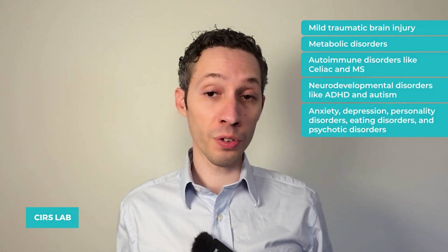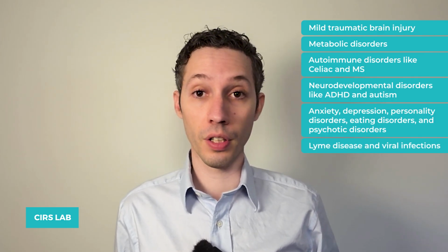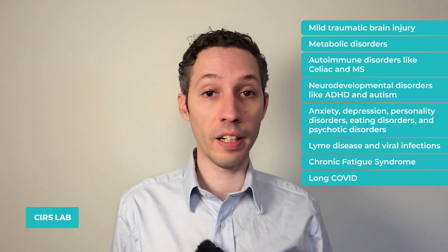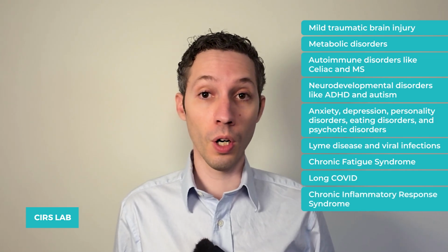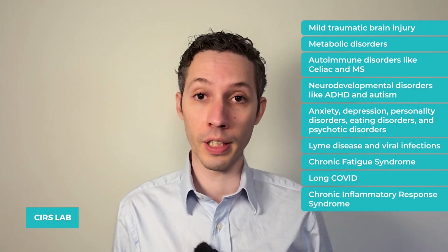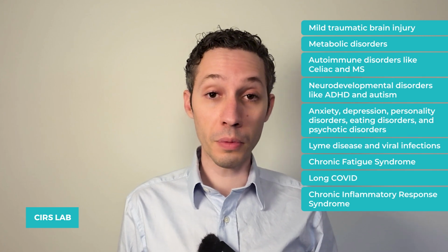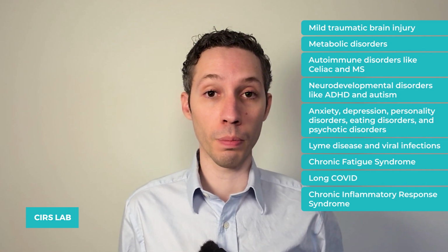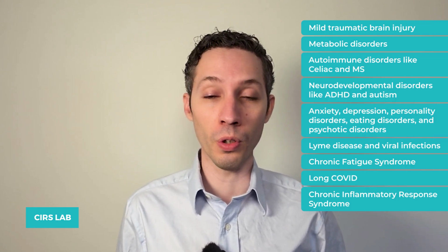Volumetric changes have also been documented in chronic infections like Lyme disease and viral infections, in chronic fatigue syndrome, long COVID, and in environmentally acquired illnesses such as chronic inflammatory response syndrome, also known as CIRS or biotoxin illness. Across these conditions, brain volume abnormalities often correlate with symptom burden, disease severity, and in many cases, treatment response, even when conventional imaging appears unremarkable.